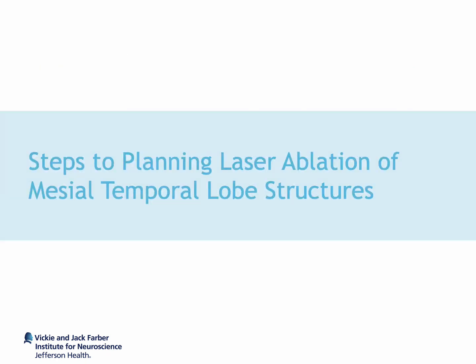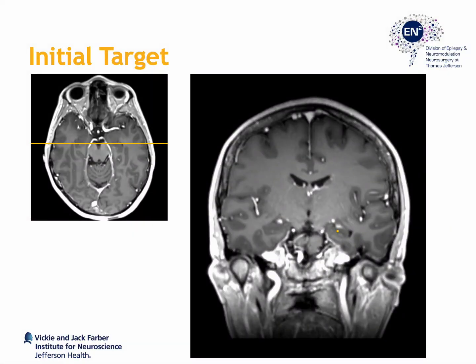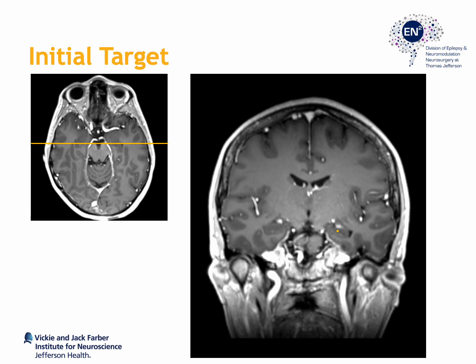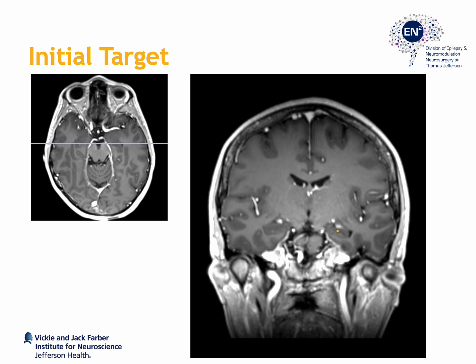Now let's take a look at the steps towards planning a typical trajectory through the long axis of the amygdala-hippocampal complex used for treatment of mesial temporal lobe epilepsy. Given the length of the overall trajectory, my general approach is to set a series of intermediate targets and intermediate entry points. My first target is at the level of the hippocampal head, where I pick a point within the hippocampus itself, located between one third and one half of the way from the medial edge of the hippocampus.